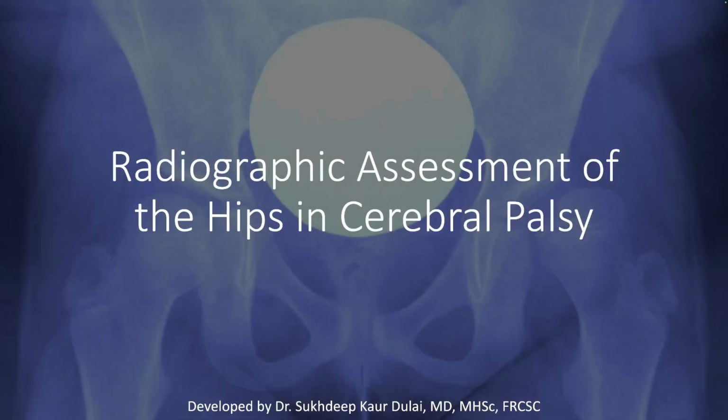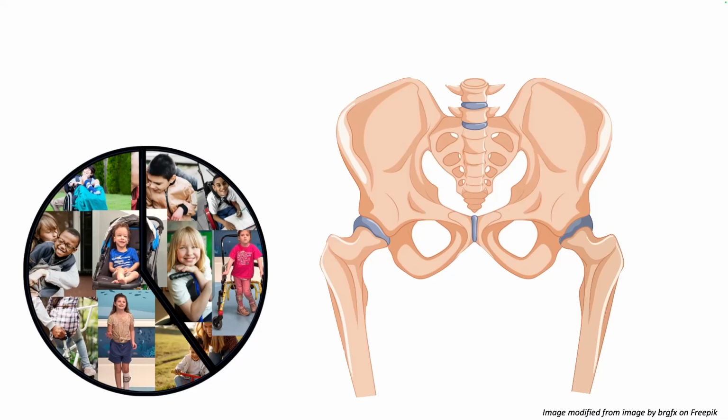Welcome to this module from the Hip Hope Network, where we will review the key principles of radiographic assessment of the hips in children with cerebral palsy. This video is intended as an educational resource for medical professionals managing children with CP.